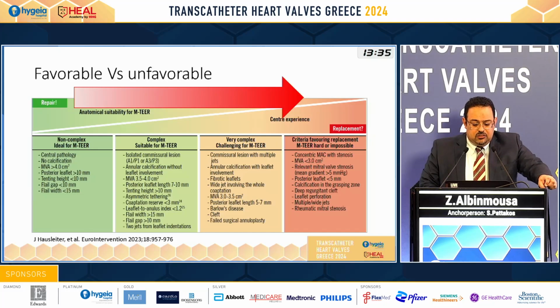However, I like to use the terminology favorable or unfavorable, because as your experience grows, you will be able to do more complex and less favorable cases.